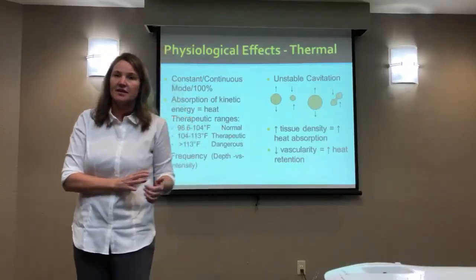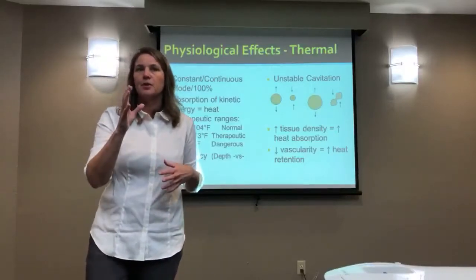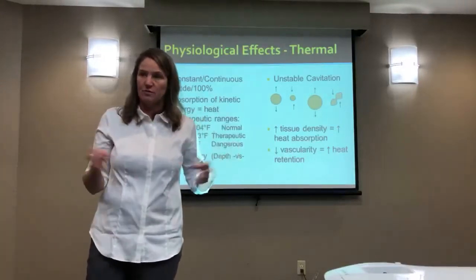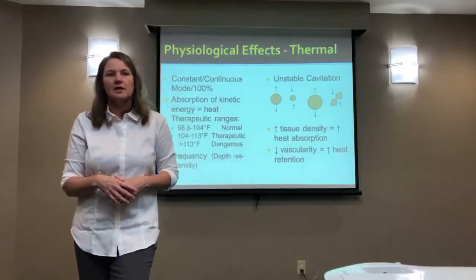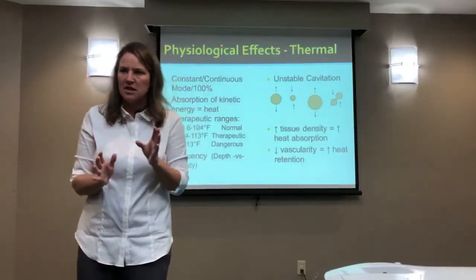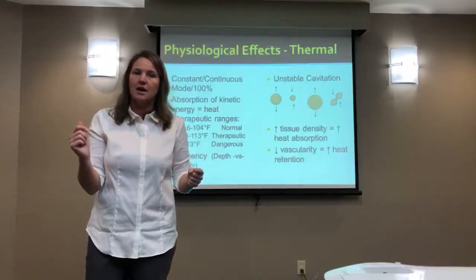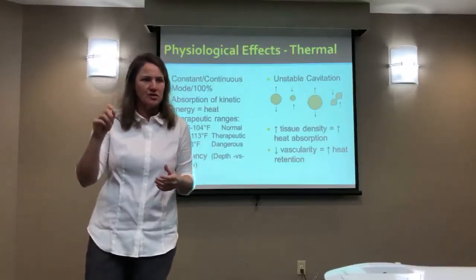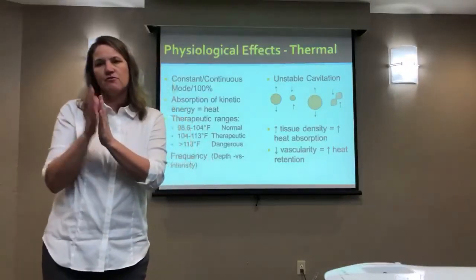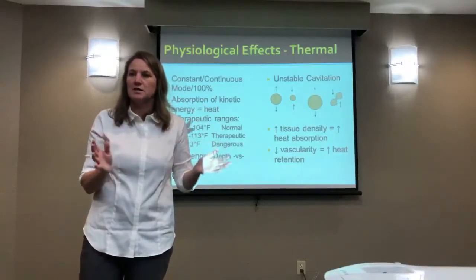of stretch. And he's an athletic trainer and researcher, and in my mind, the purpose an athlete might be using these modalities would be to heat and stretch a tissue, make it longer, make your range of motion better. And so this study, the stretching window, was basically if I heat this tissue up, whichever modality you're going to use to heat it, but you heat it up nonetheless, and you get it into that window where your stretch is going to be more effective, that plasticity. You don't have a lot of time, because when you're done with your treatment, it's going to cool off quickly. So it was basically the 4 minutes stuck in my mind, and then 15 minutes was basically everything's back to normal. Everything had the capacity to be cooled off completely.